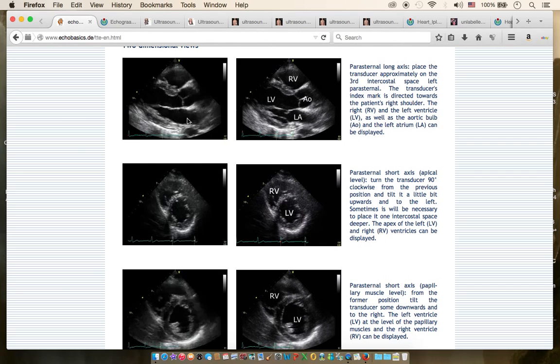Two things here I want to mention. You see, this is the mitral valve, and you see the mitral valve moving 2 times. That means it opens 2 times. One time, as I said, during systole, the blood comes from the pulmonary veins from the lung to the left atrium and fills the left atrium. And during diastole, more than 75% of the blood goes to the left ventricle.